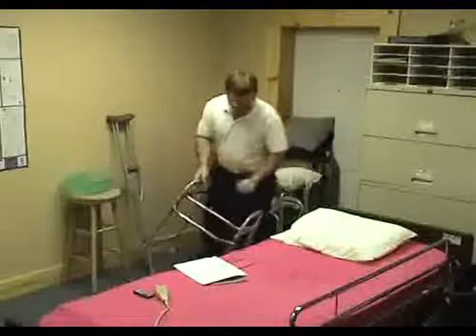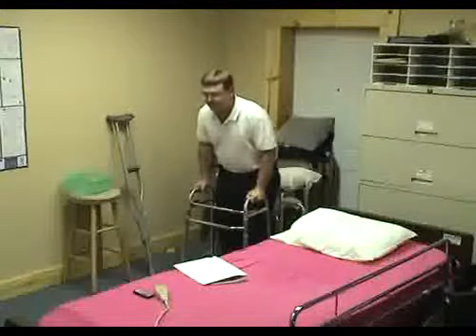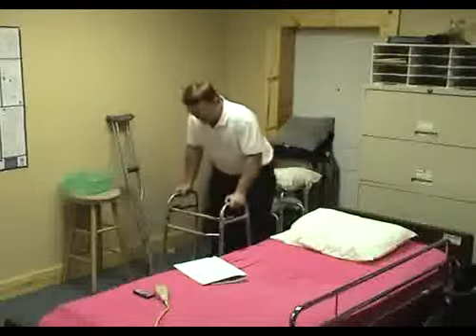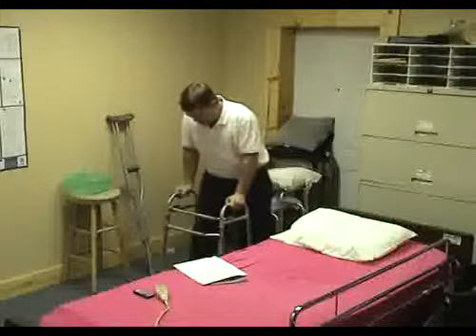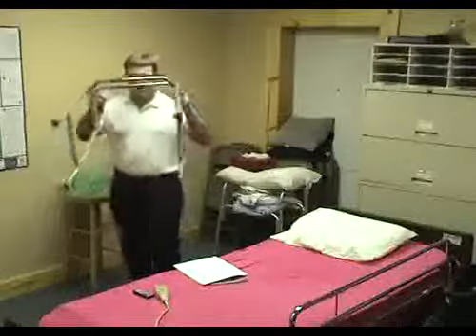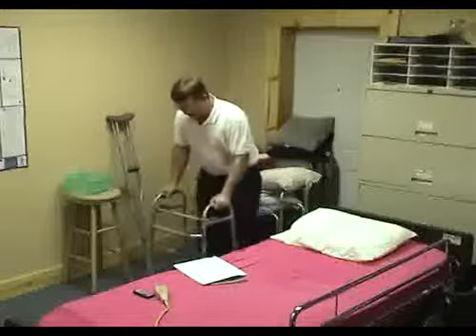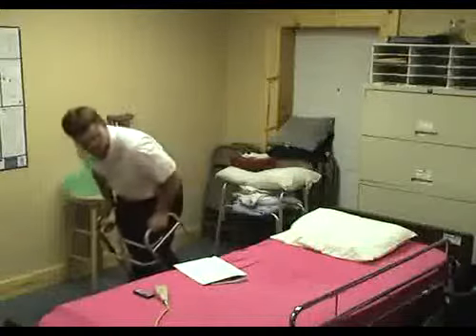How many of you have seen elderly people use a walker and they go like this? Carry it. That's not how you use a walker. You don't want your heels to come inside the box that's underneath it, that all the legs make. See that, like a rectangle? Use your imaginary lines all the way across. You don't want them to get their feet all the way in here, because if that happens, they're going to fall.